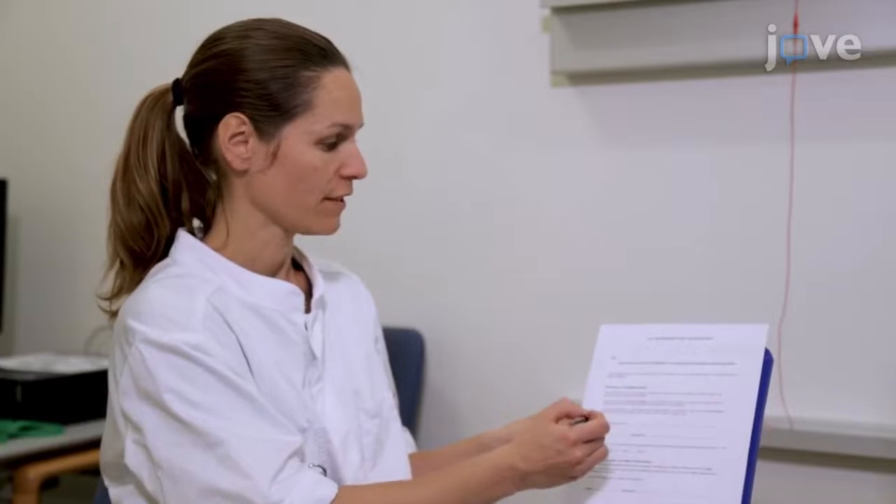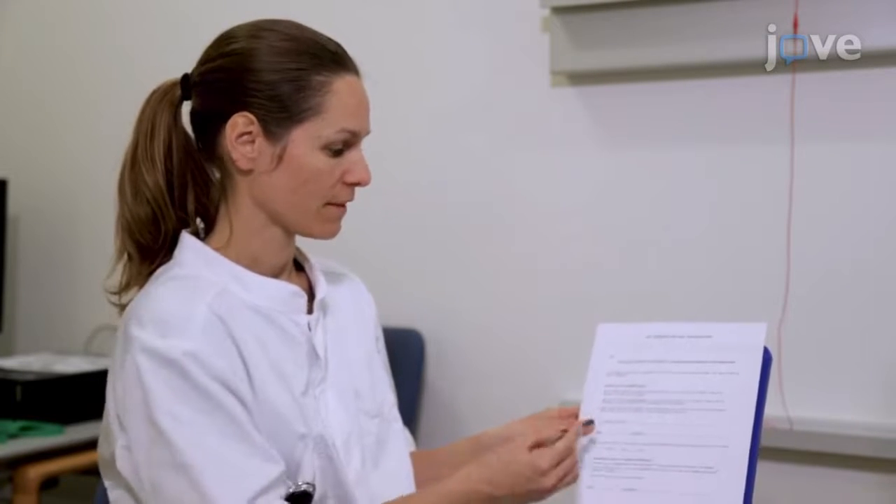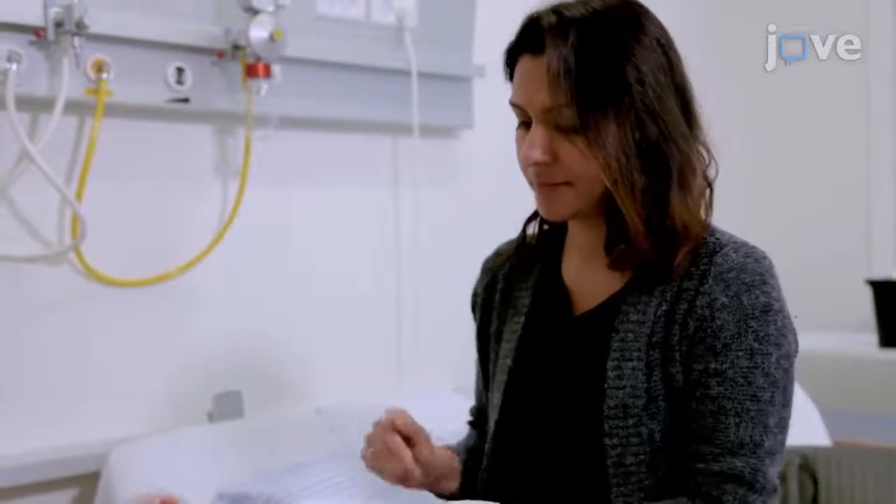To begin, assess the subject's medical history to ensure that they do not have any previous nervous system disorders other than the disease group being investigated. Inform the subject in detail about the examinations and request written consent.